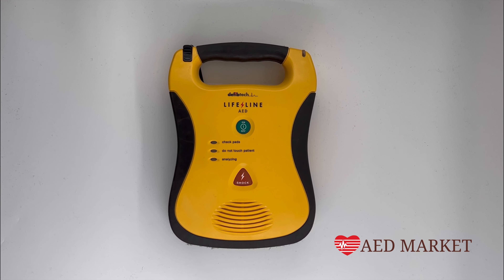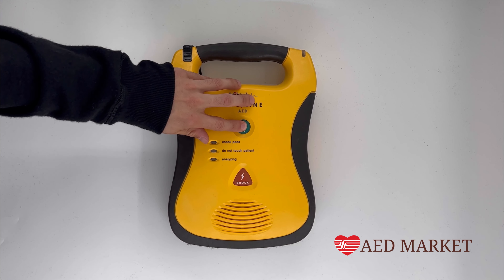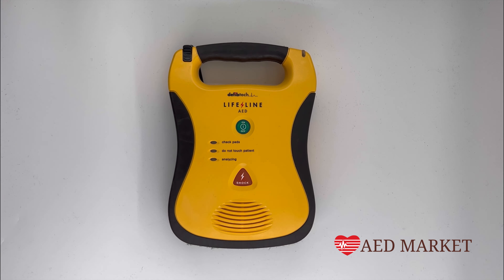After you've successfully replaced the pads and battery, ensure that the active status indicator is flashing green, indicating that your AED is in a rescue-ready state.